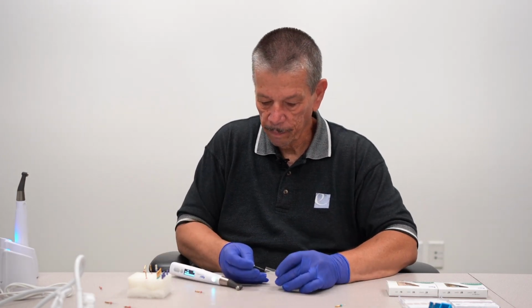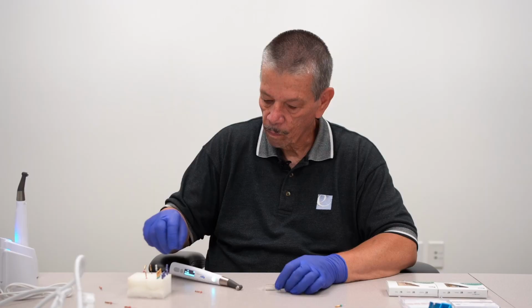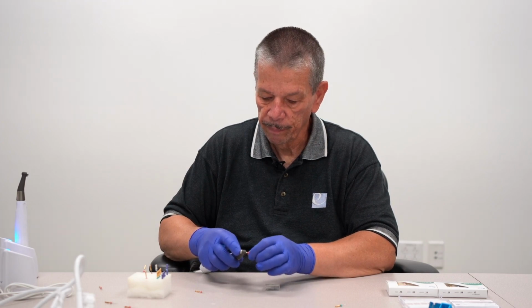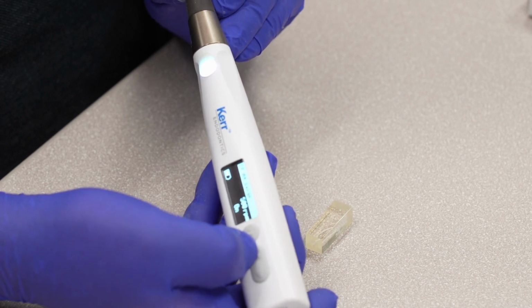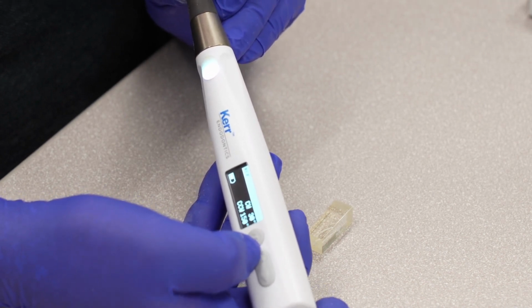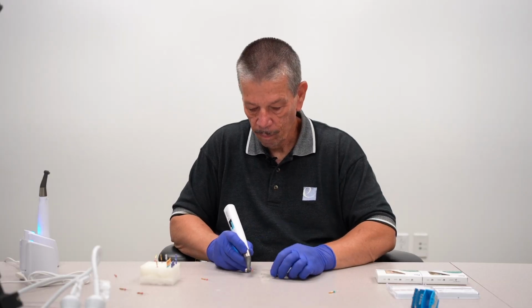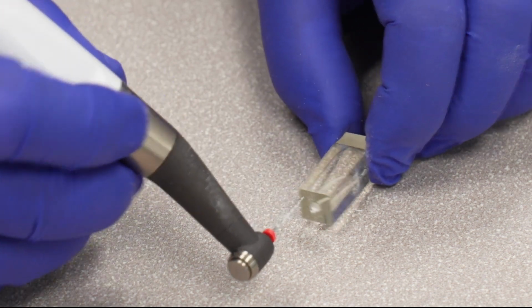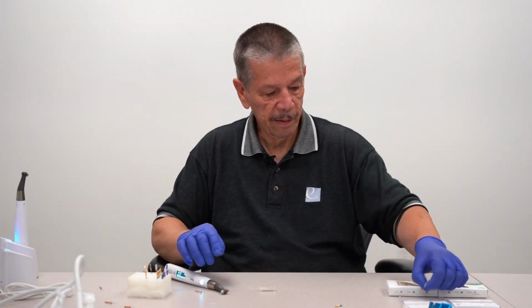Recapitulate. ZenFlexONE primary file set to reciprocation. And you're done. Gutta percha fit.